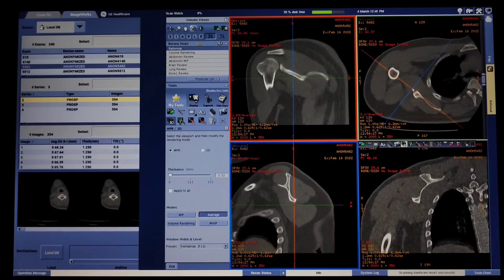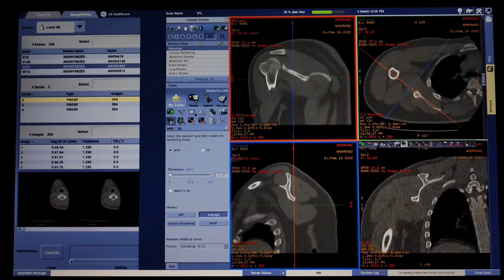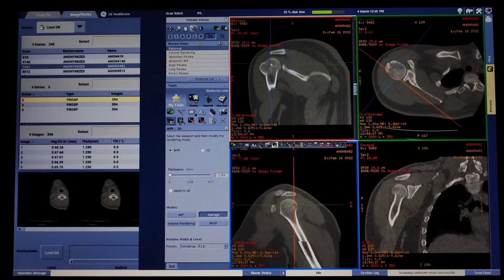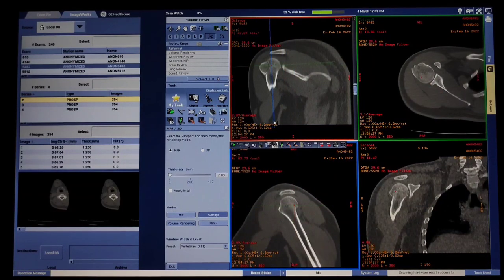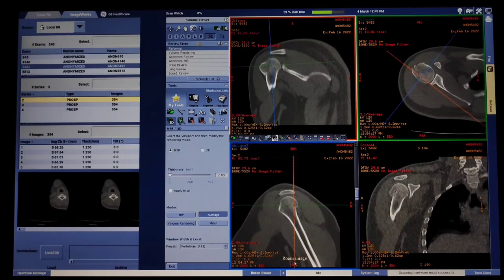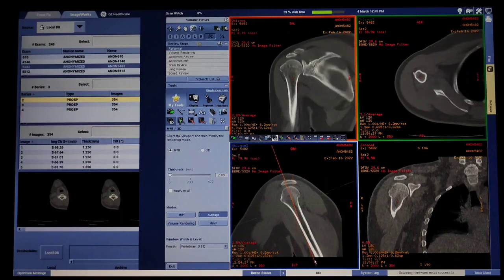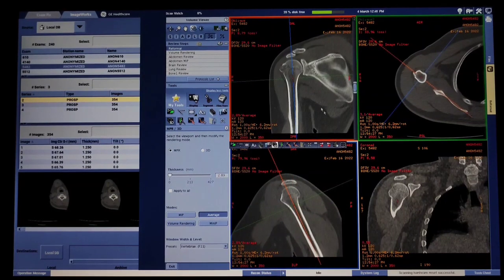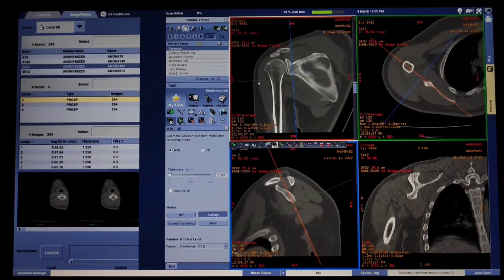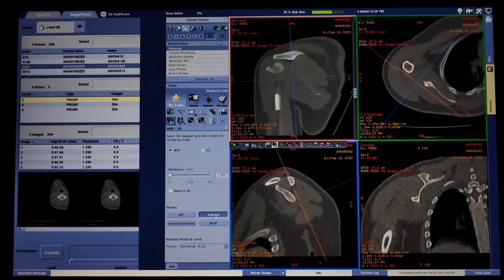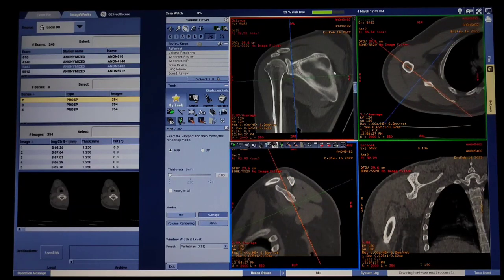Your diagram has to be parallel-like, selecting both at the same time, checking the alignment in one direction. In the size image, you also have to parallel the orange line with the humerus. To decide if it is symmetrical, in coronal images at least one image should show a complete scapula with the humerus. As you can see, we are getting a complete scapula with the humerus. Now axial, coronal, and sagittal are symmetrical properly.